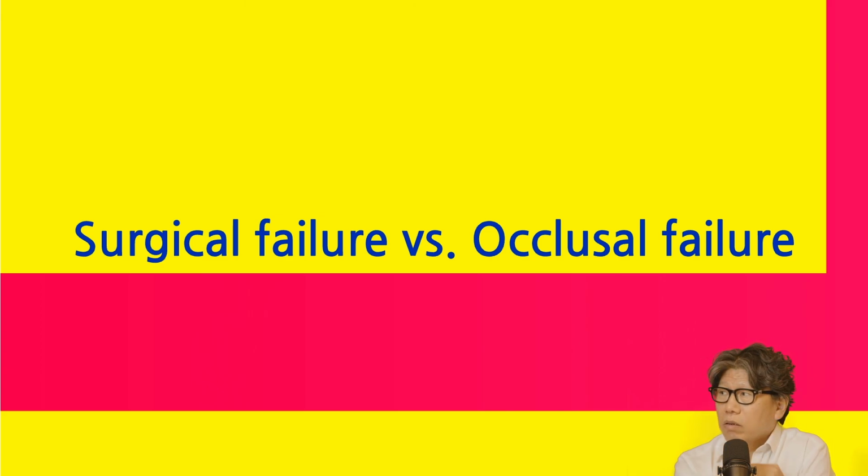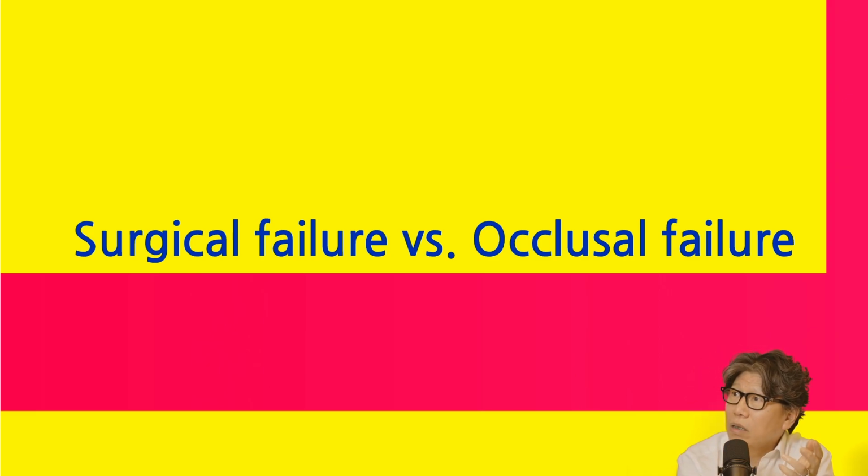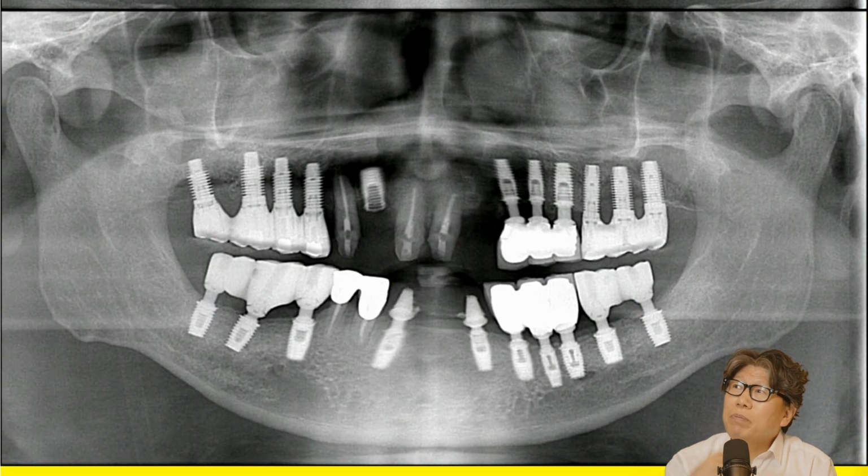You can't go wrong with surgery, if you think about it. But most of the time, what they say is that the surgery went wrong. It's been over a month since the prosthesis is in. How can that be a botched surgery? What's wrong is this. If it's in the wrong position, if it's in the wrong orientation, if it's a custom abutment, if it's forced to be oriented, then it's the surgeon's fault. But if the fixture is in a good position, in a good orientation, then it's not the surgeon's fault. Even if it's over 10 years old, if it falls out, the failure is on the occlusal side, not the surgical side. And it's actually a failure of the implant design in this case.